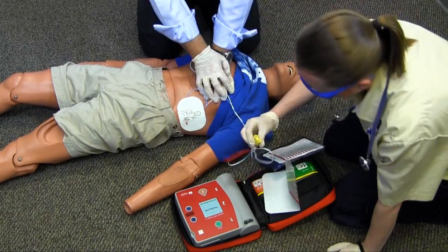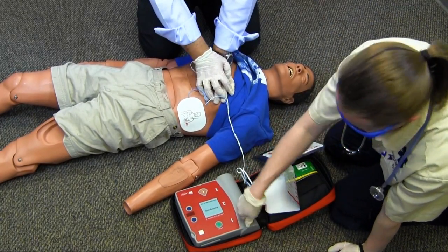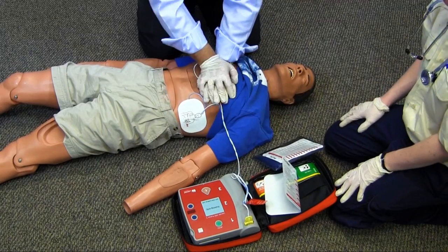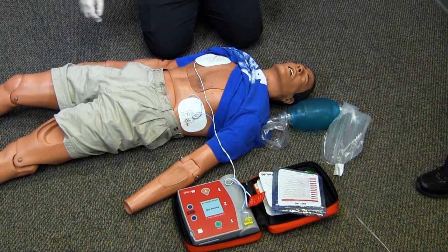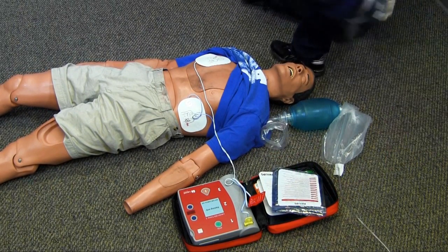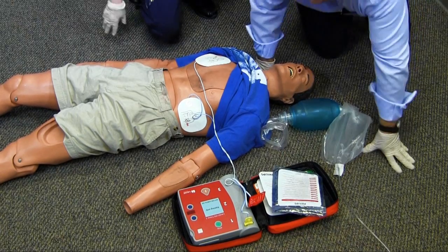I turn the AED on. While I am prepping the patient's chest, I listen to the prompts from the AED. I connect the electrodes to the AED and ensure nobody is touching the patient while the AED is analyzing.